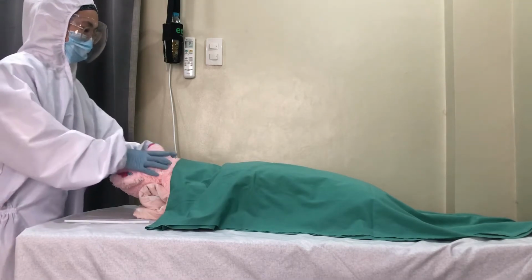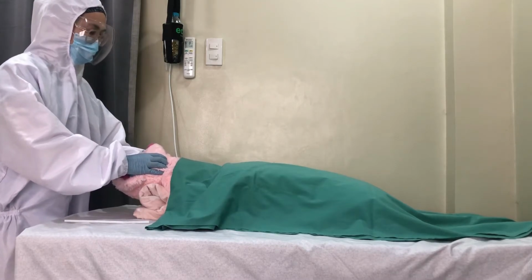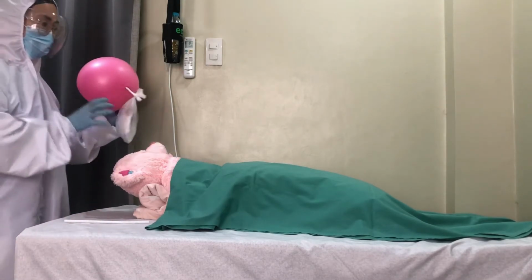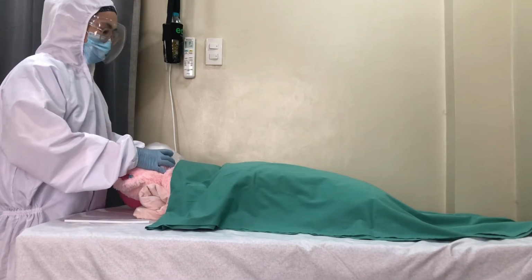Prior to induction and pre-oxygenation, we will suction the mucus plug and all secretions. Perform a chin lift or jaw thrust maneuver. For pre-oxygenation, apply a tight-fitting bag valve mask and pre-oxygenate the patient.